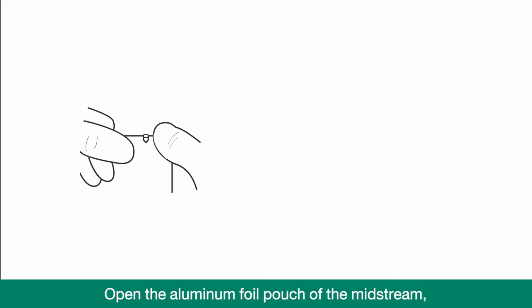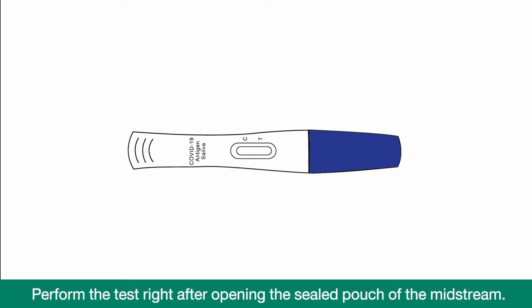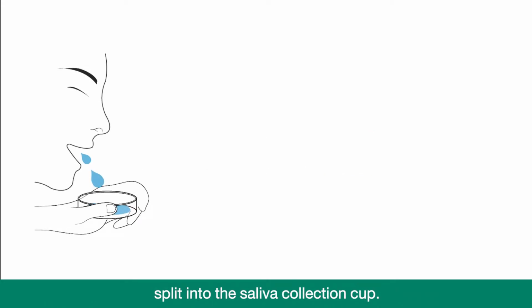Open the aluminum foil pouch of the midstream. Make sure the midstream is intact. Perform the test right after opening the sealed pouch of the midstream. Spit into the saliva collection cup.